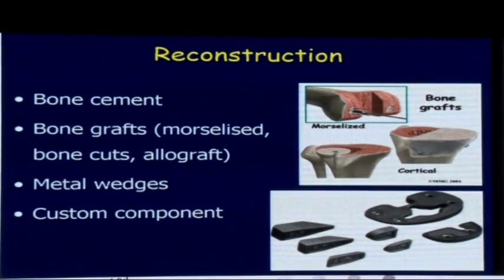So what happens with reconstruction? You can simply use bone cement, you can use various types of bone graft, metal wedges, or go for a custom-made implant. All of them will allow you to achieve what you really want to achieve.